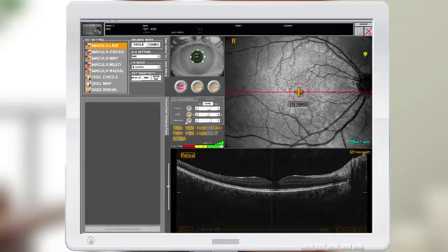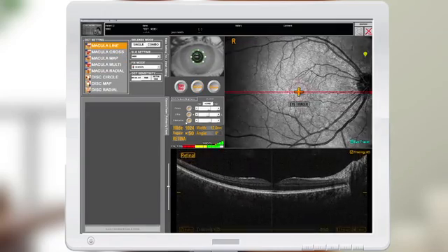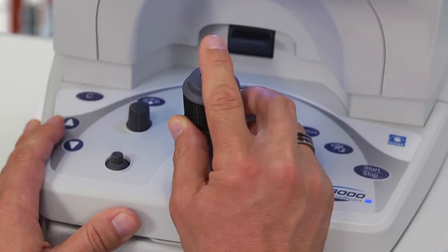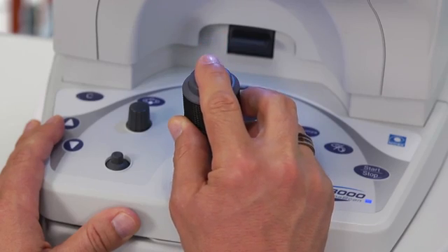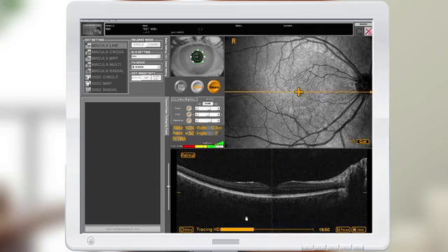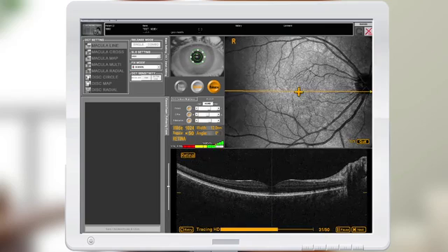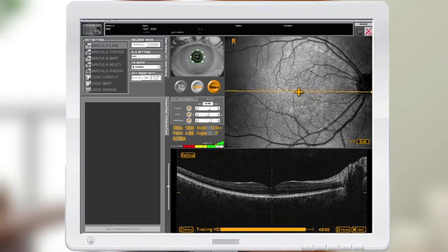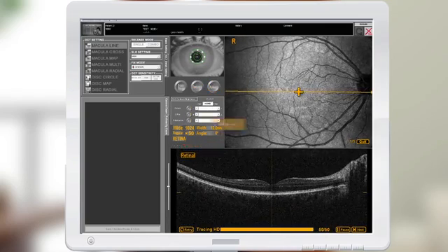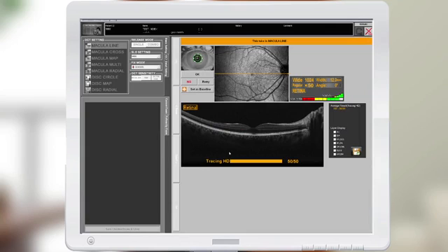Once you're comfortable with your signal strength and your line scan position, press the button on the joystick. As you can see, we are averaging 50 images. The scan is complete. You can select OK, no good, or retry, or set it as a baseline for follow-up exams.